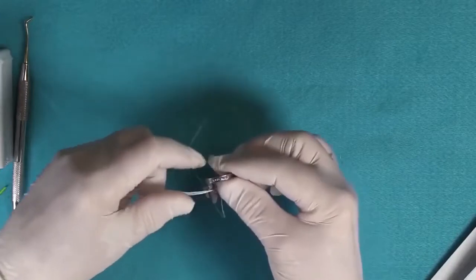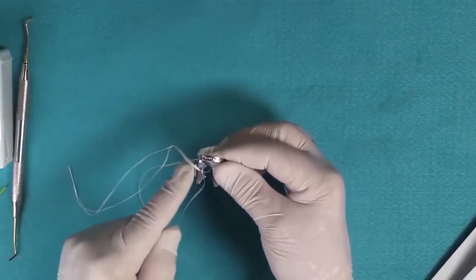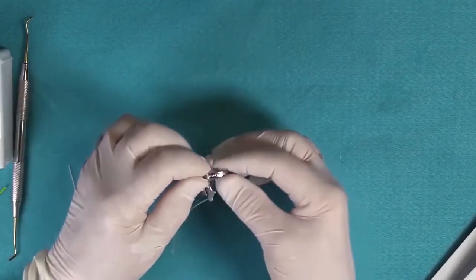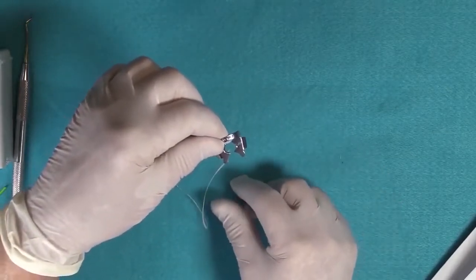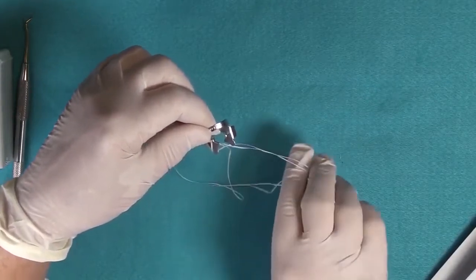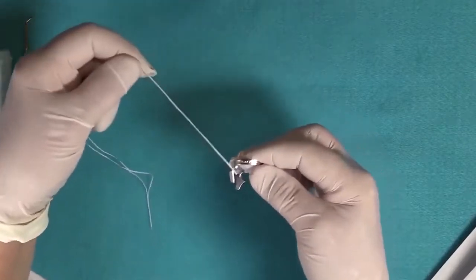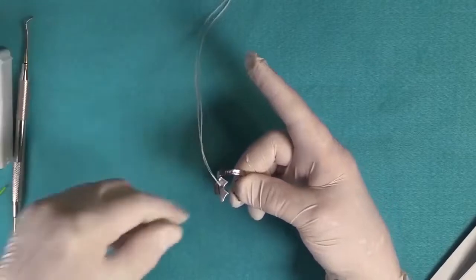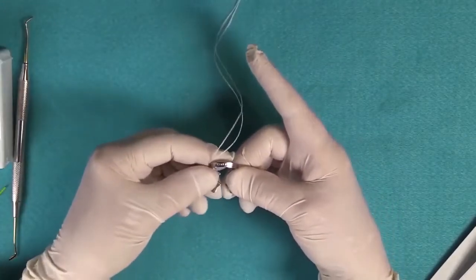Now we're going to isolate tooth number 19. So that means this side of the clamp will be on the lingual and this side is on the buccal. So we start with the floss through the lingual side of the clamp. And we're going to make a slip knot, or some of you might know it as a luggage knot. Just take the end and feed it through the loop and pull tight until the knot is tightened into place. Make sure you're on the outside of the jaw and towards the back of the clamp.